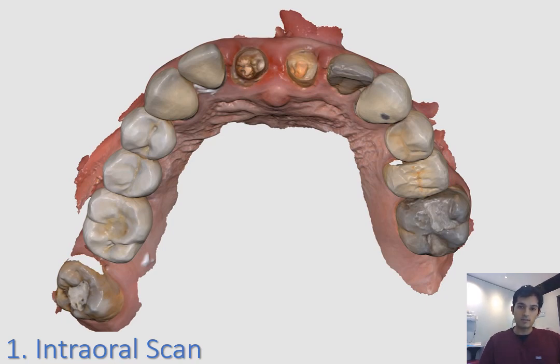Again, I'll emphasize that we spend a lot of time capturing the relevant areas, and this is the great thing with digital, you can focus on the areas that matter most with that impression. In this case it was the site of the fractured teeth, palatal and facial to those teeth, as well as capturing all the surfaces of the teeth that would hold the guide, which would be 2 or even 3 teeth on either side of these ones which are fractured. Posterior to that, if you get a couple of holes or gaps in the scan, as you can see here, you really don't have to spend the extra time going to fill those in, because you can get the job done just by getting the relevant information.